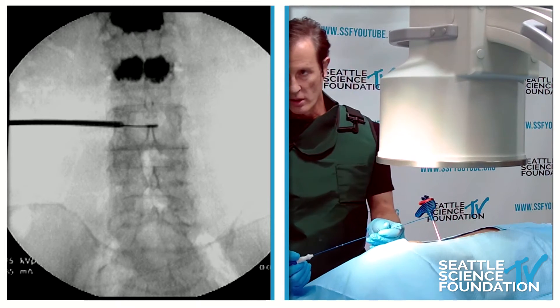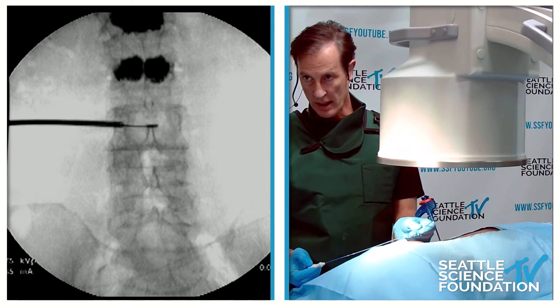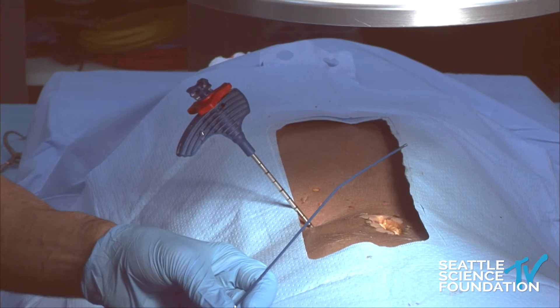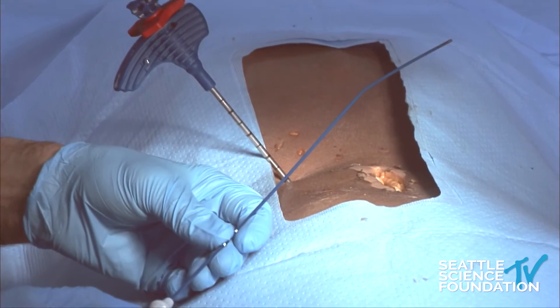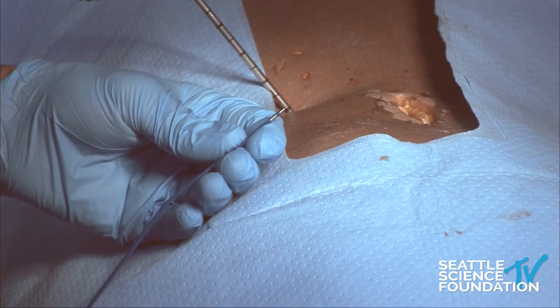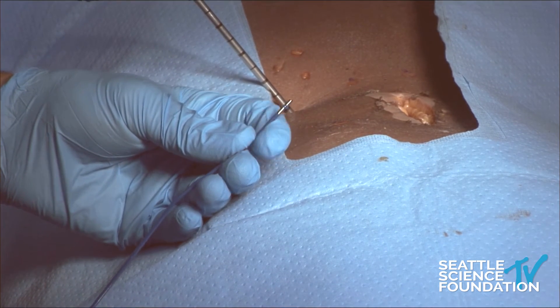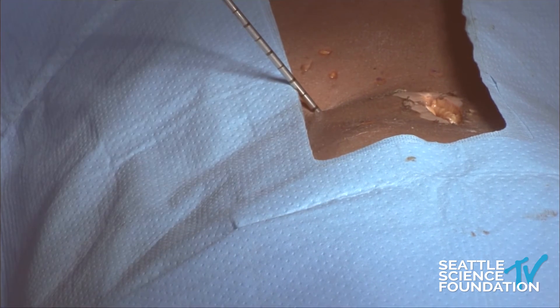The probe has a distal tip that is bipolar and proximal marker bands. Here are the marker bands proximally, and I'll show you the significance of these in a second. The distal tip is a bipolar burn, and we center this over the spinous process in the center of the vertebral body.